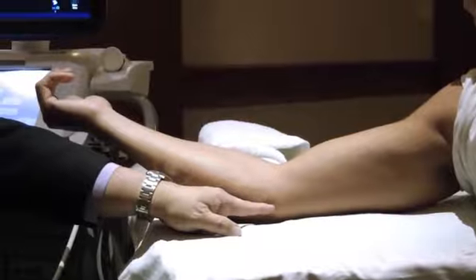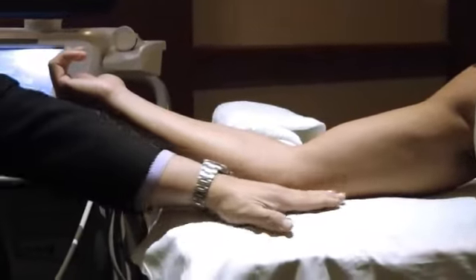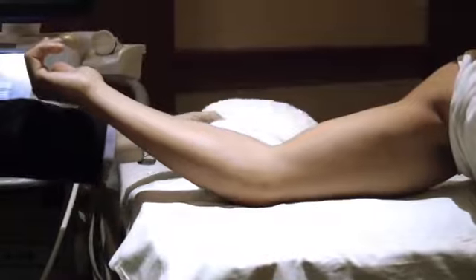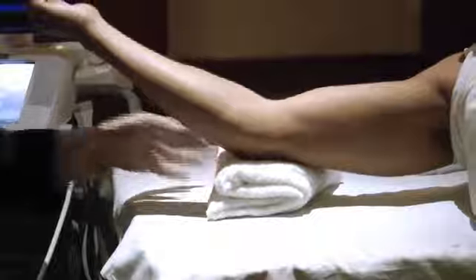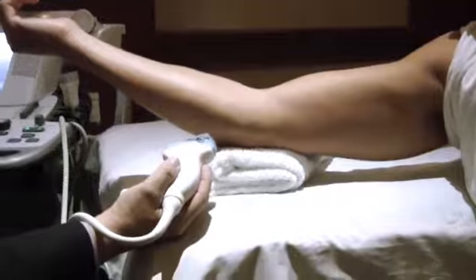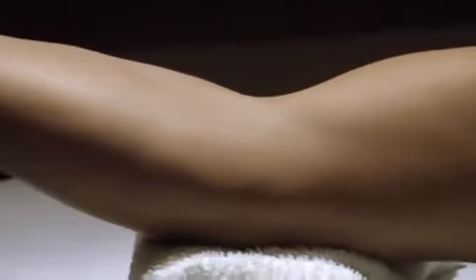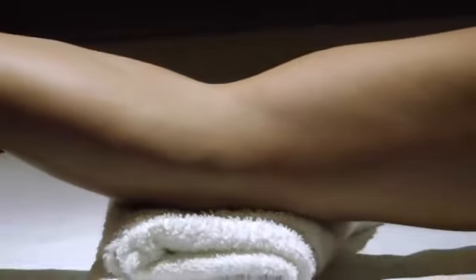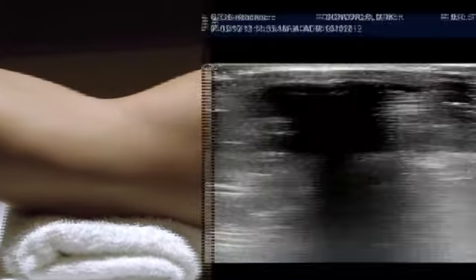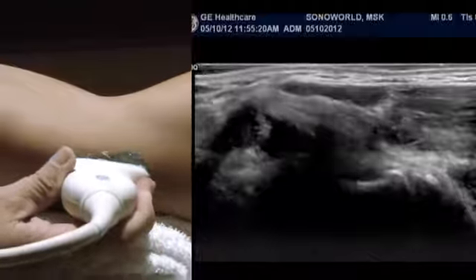We're going to look for the anterior bundle of the medial collateral ligament. There's no space between the medial elbow and that of the table. So with a rolled up towel, we're going to bolster the elbow, where now I have sufficient space in order to look for the anterior bundle of the ulnar collateral ligament. We are going to identify the bony acoustic landmark of the epitrochlea and connect it to the sublime tubercle in the coronoid process.